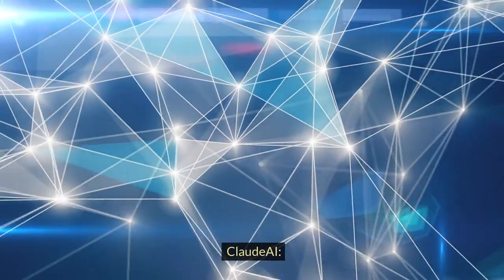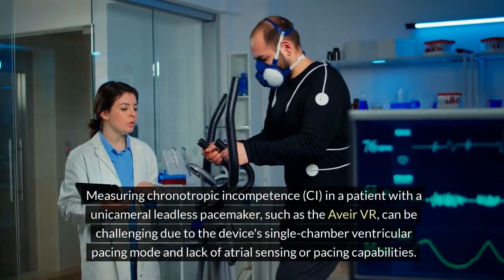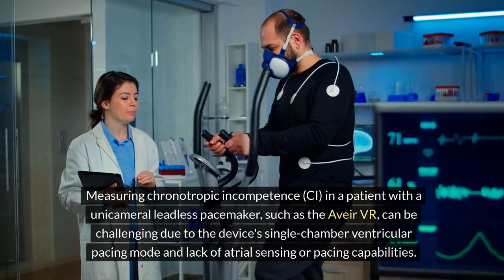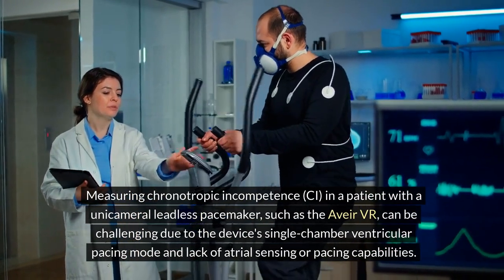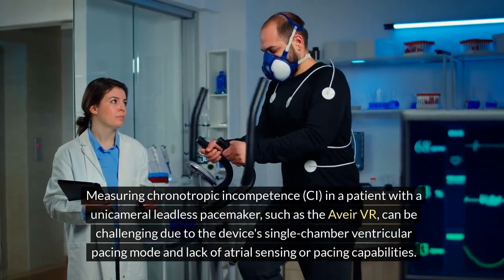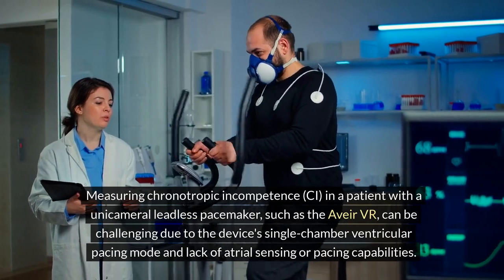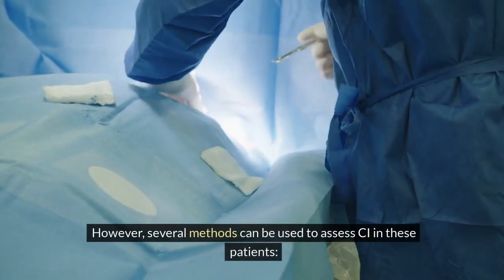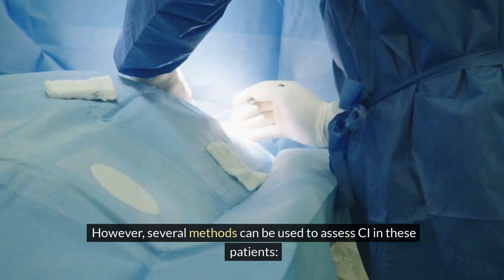Claude AI. Measuring chronotropic incompetence, CI, in a patient with a unicameral leadless pacemaker, such as the AVEIR VR, can be challenging due to the device's single-chamber ventricular pacing mode and lack of atrial sensing or pacing capabilities. However, several methods can be used to assess CI in these patients.